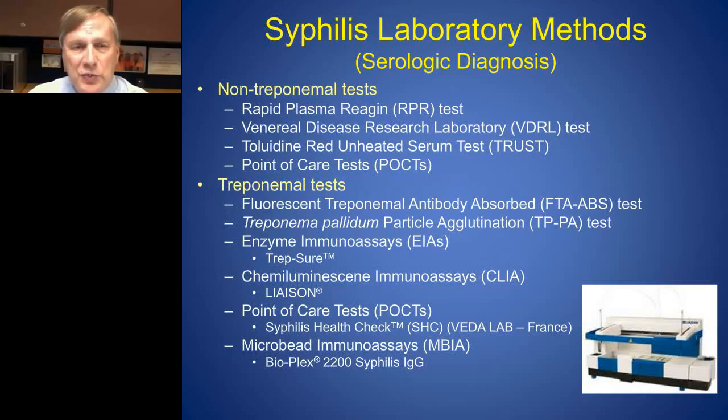Now let's look at some of the specific non-treponemal tests. The RPR tests. I think one of the first companies that came out with an RPR test was probably BD, an excellent RPR test, still a good test. There are other manufacturers that make RPR tests. They're all good tests, and the ones in the U.S. have all been FDA cleared.